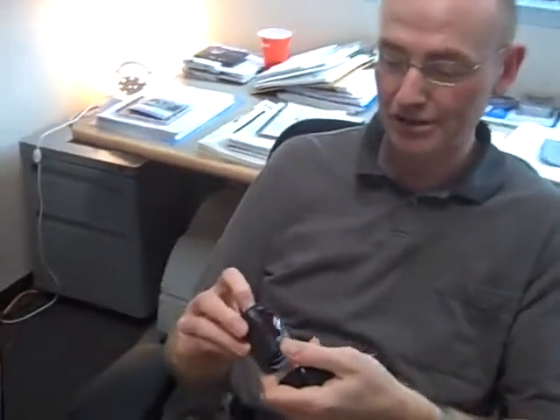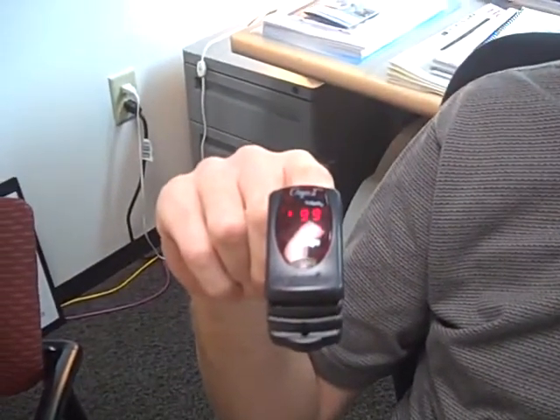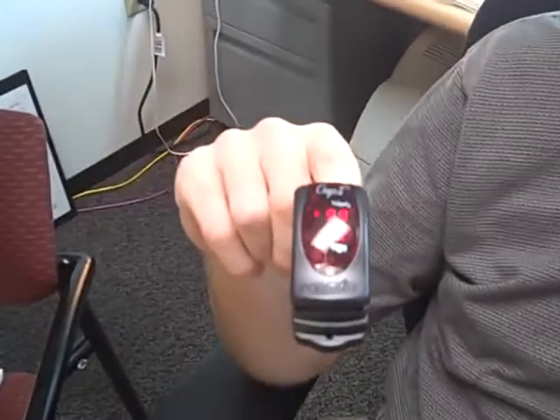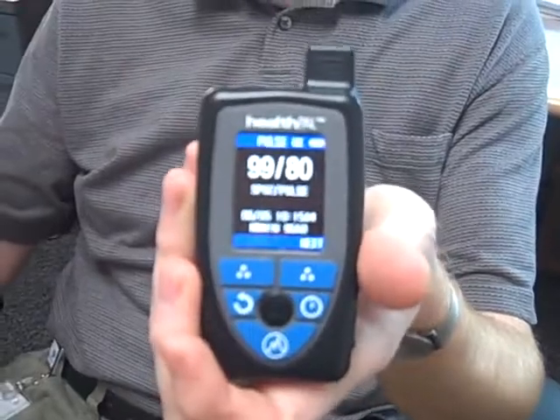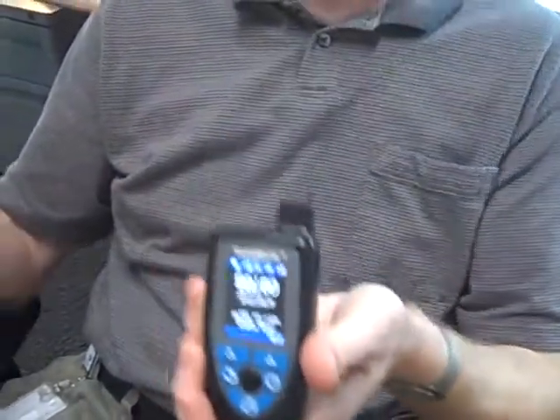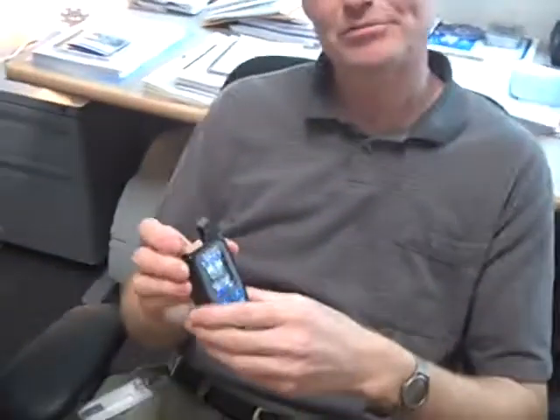This is actually a wireless device that can connect to a number of different units. I'll use a pulse oximeter from Nonin here. So you're now grabbing your pulse - that's the blood oxygen level reading. Your pulse oximetry is 99%. This device captured that reading and once it does that, it can connect wirelessly through a GSM or CDMA connection - essentially using a cell phone connection. From the oximeter to this hub was Bluetooth, and from here it's a cell phone connection essentially.